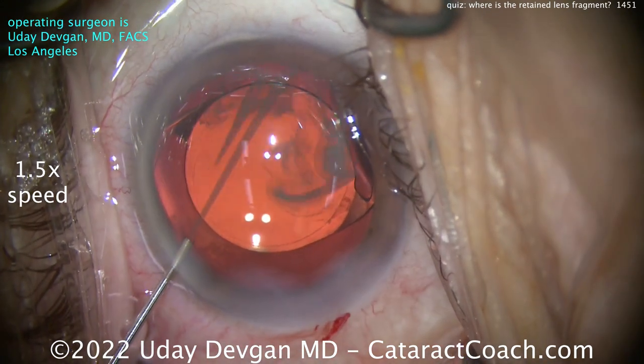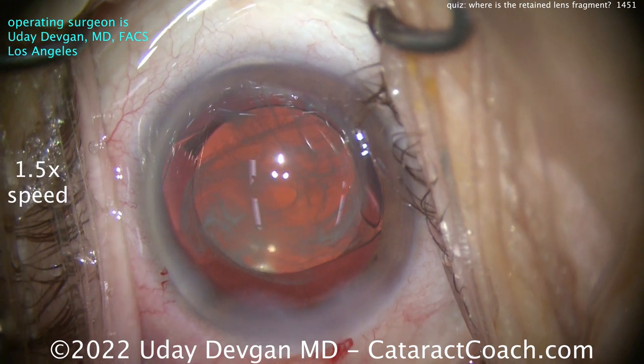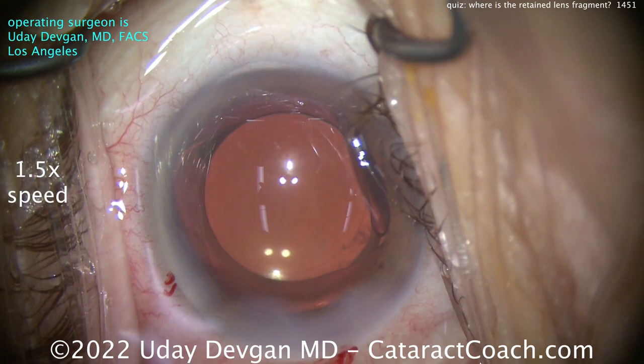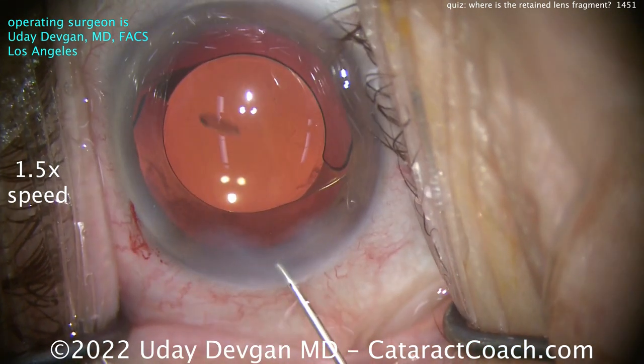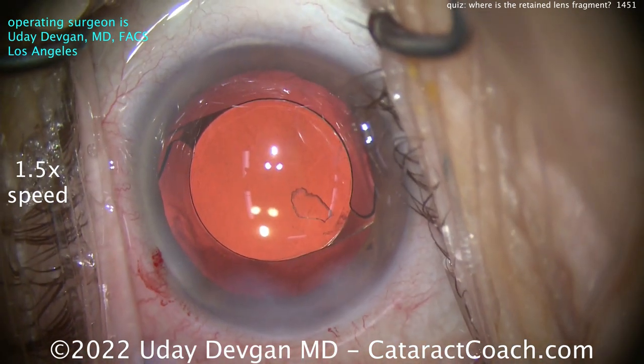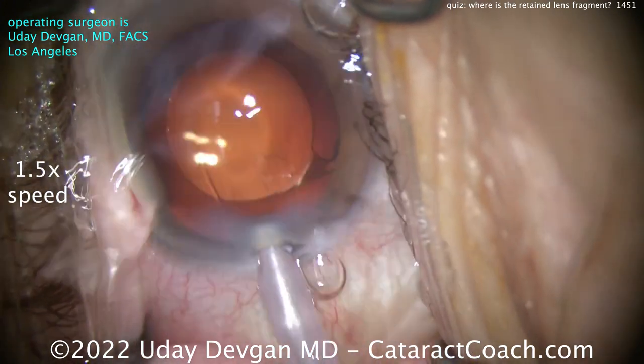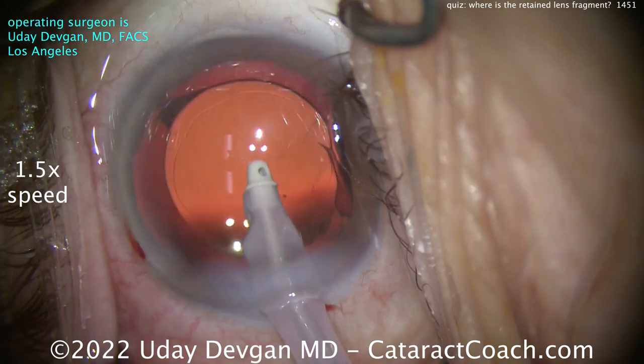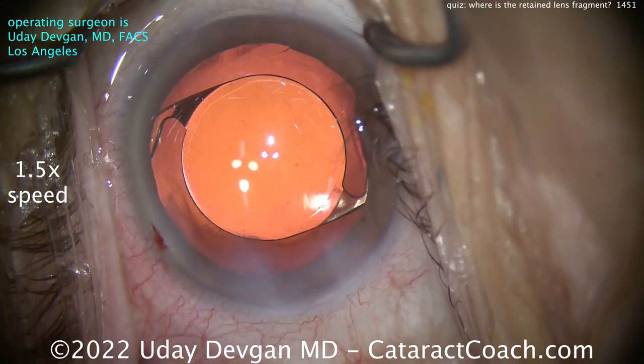Let's put some triamcinolone on the eye, swirling around. Getting ready to put some moxifloxacin in — whoa, whoa, whoa! I saw that big piece! You see that piece? There it is. Let's take it out. You got the piece out, right? Agreed — piece is out of the eye.